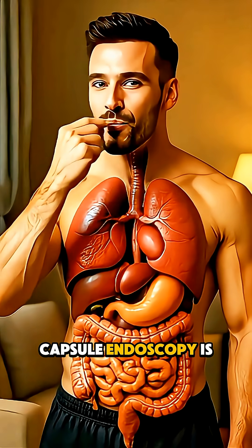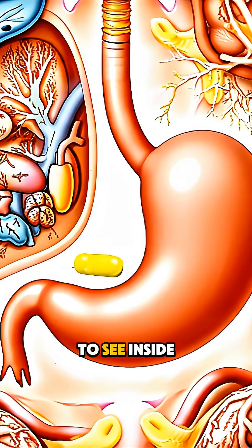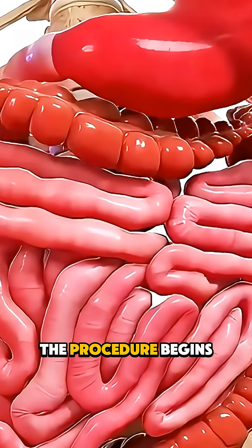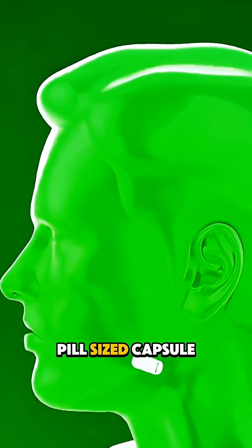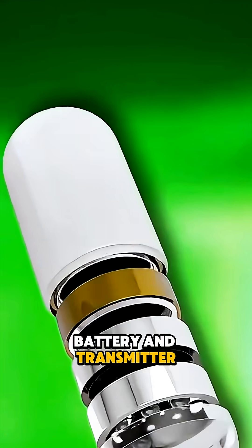Ever wondered how capsule endoscopy is performed? It's a simple, non-invasive way to see inside your digestive system, especially the small intestine. The procedure begins with swallowing a pill-sized capsule that contains a tiny camera, light, battery, and transmitter.